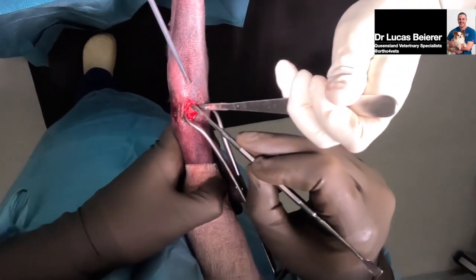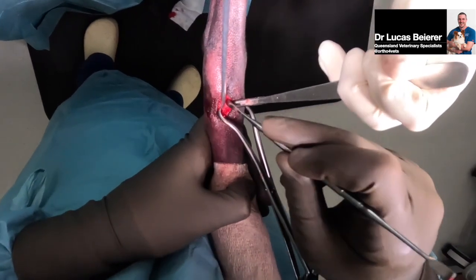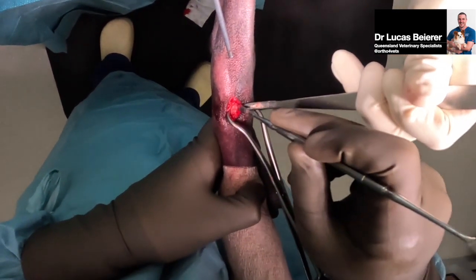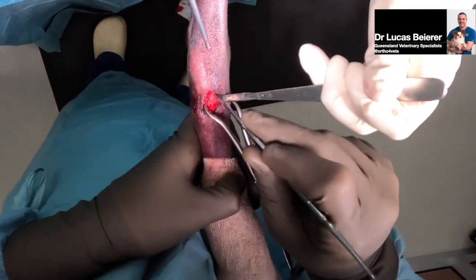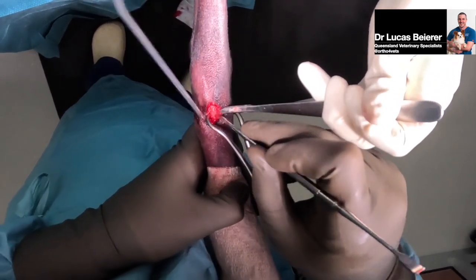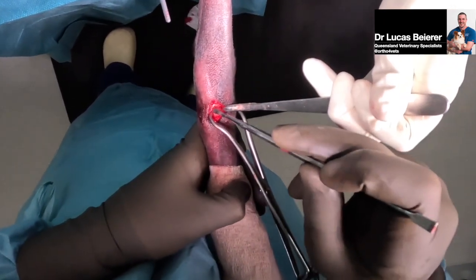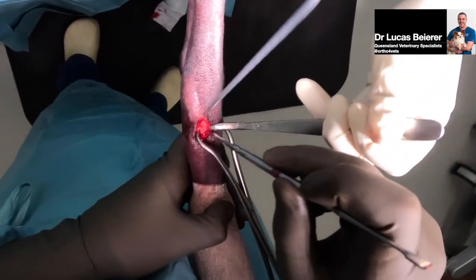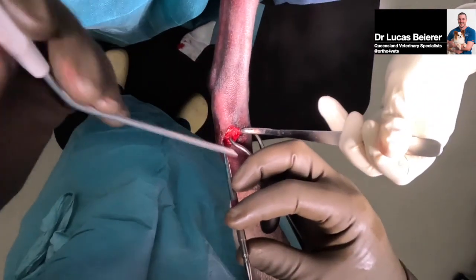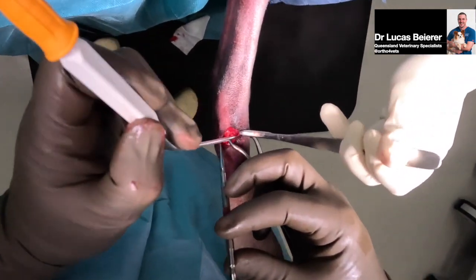So that's the dorsal piece just there, which looks like it's aligning into that actually quite nicely. So might try and put a small little positional or lag screw through that and then run our larger implant across the top. Just need to be careful of sword fighting that follows.